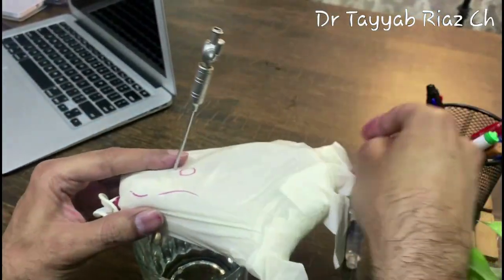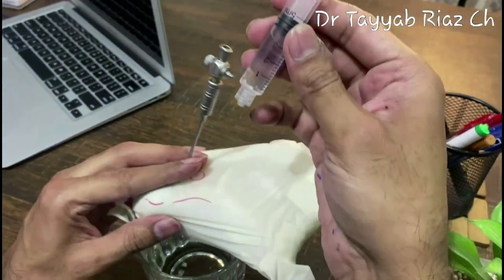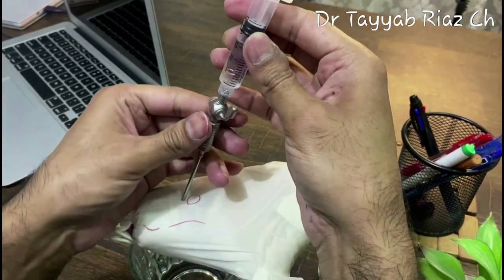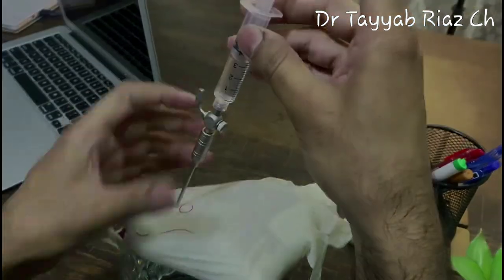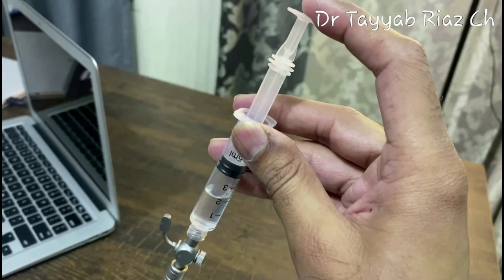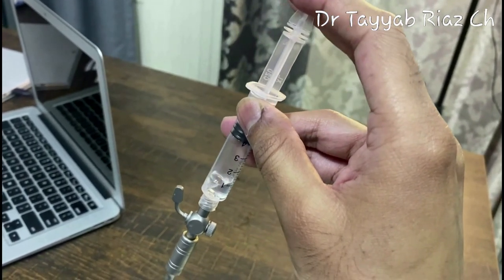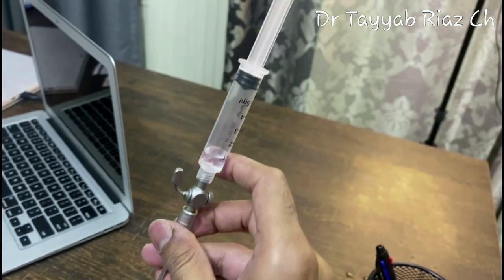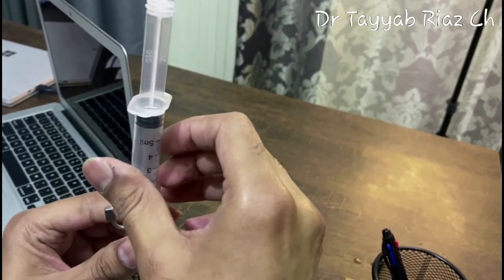It means we have crossed the peritoneum. But to confirm, we will again do all these three tests. First, attaching the saline filled syringe and doing the irrigation. As I already told, it will get easily irrigated, but when you pull back the plunger, there will be no saline coming back. As you see, it is only air, but in reality there will be negative suction due to the negative intra-abdominal pressure.